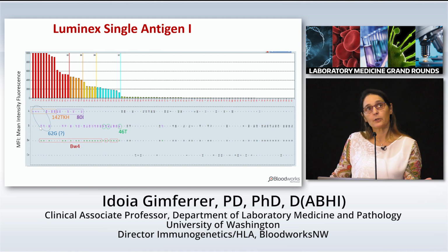This is important for us because we want to account for every single bead reaction, so we know we are dealing with a real antibody. Sometimes there is background reactivity, and that helps to understand, oh, this is background, I cannot account for an epitope, but this is real because there is an epitope.